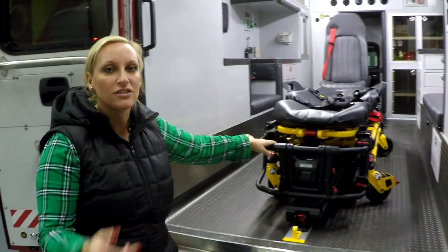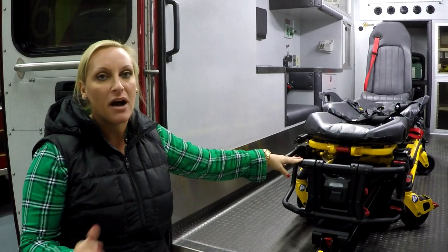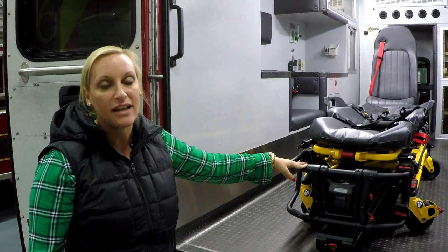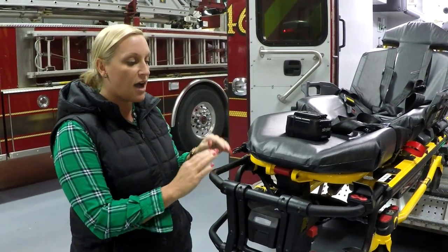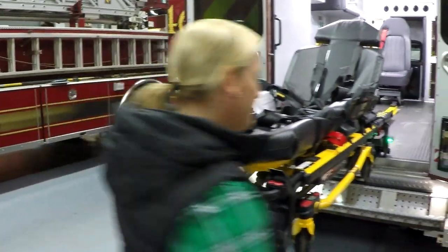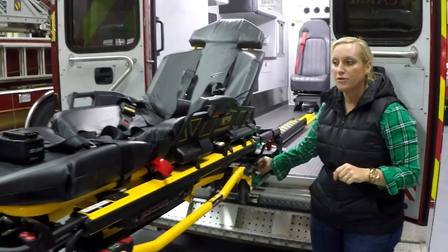Now that we've covered loading and unloading, we'll briefly go through the manual backup options — these are incredibly unlikely to be needed, but just so you know. Let's say this cot does not have power and the battery is dead. There are functions on the side of your power load that will still allow you to release it.